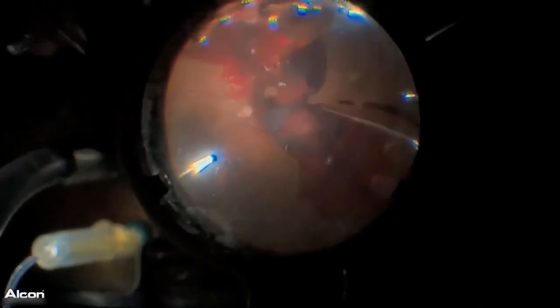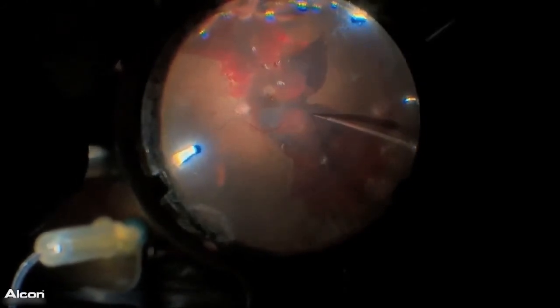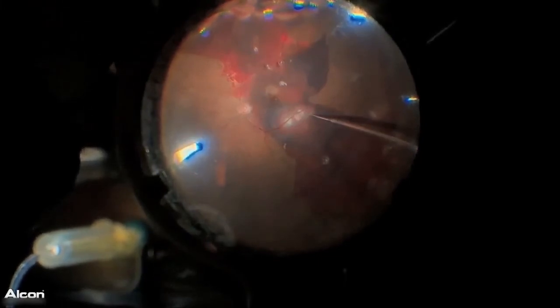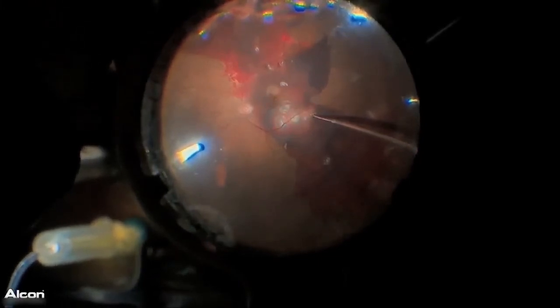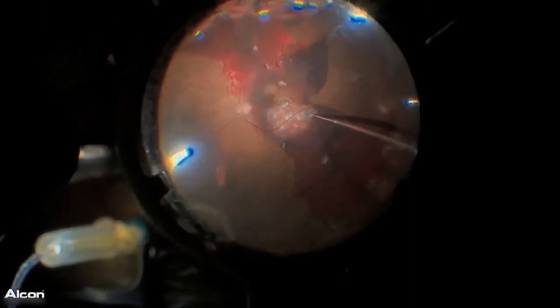So I'm using the 3D system, the 3D engineering system, to inject air into the subretinal space before injecting TPA, to dislodge some of the macular hemorrhage. I injected the air into the submacular space with a microneedle, which is a 47 gauge microneedle. It's the smallest one in the world.